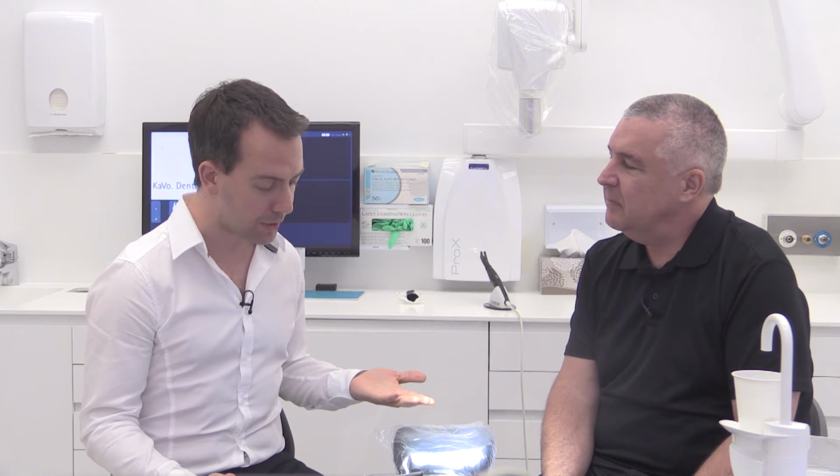Now, do you feel that a DIAGNOcam can take the place of an intraoral camera? There's a question here, can DIAGNOcam be changed into an intraoral camera? Well, it's, if you like, a very specialised type of intraoral camera. There are times we use an intraoral camera to show patients colour, and a really good example is I use intraoral cameras all the time to show patients gingivitis and periodontitis and things like that. So the use of colour is actually quite important. I don't think you can have a completely monochrome approach to life. I think it's really good to have some colour on an intraoral camera, so I think it's worth doing.